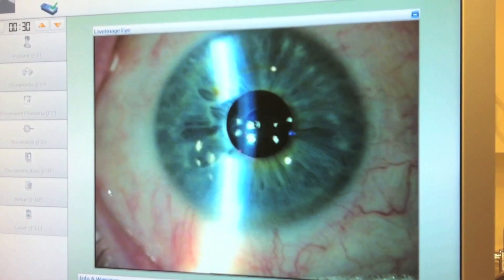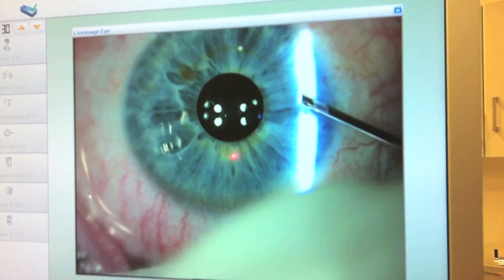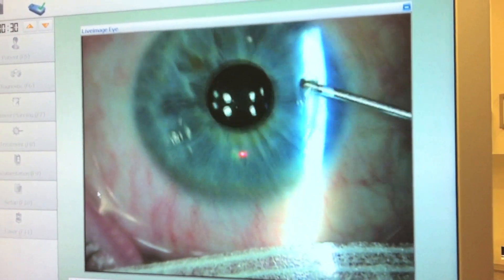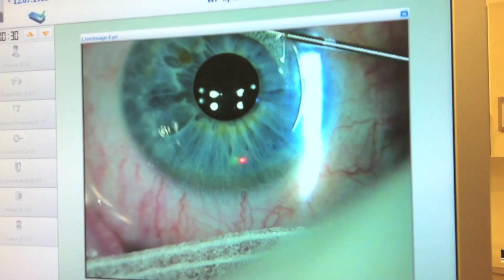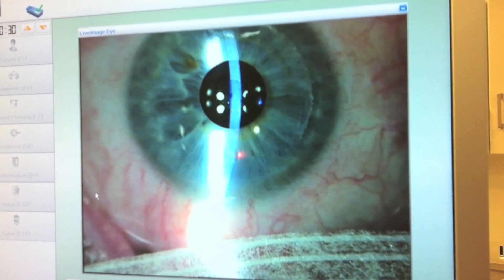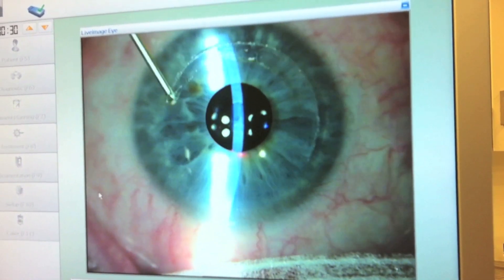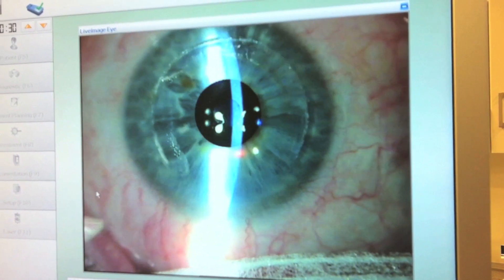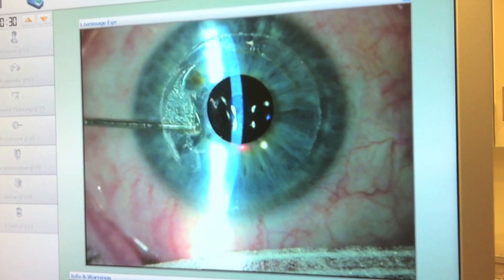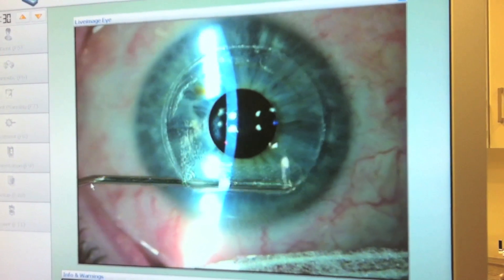When the inlay position needs to be maintained but only a refractive enhancement performed to achieve the desired refractive outcome, it is ideal to lift the flap and have the inlay stick to the flap. Mark the flap surface with a reference ink mark in the center of the inlay in case the inlay moves. Then start the flap dissection by dissecting the flap edge all the way around so that the inlay remains as a small island in the center of the flap. Make sure to free the flap adjacent to the hinge too.